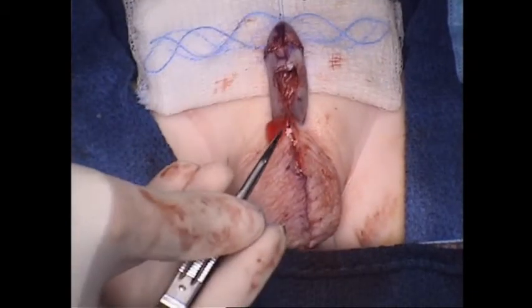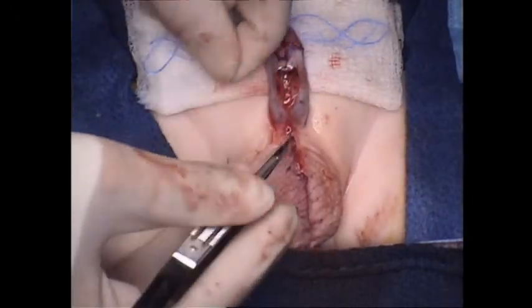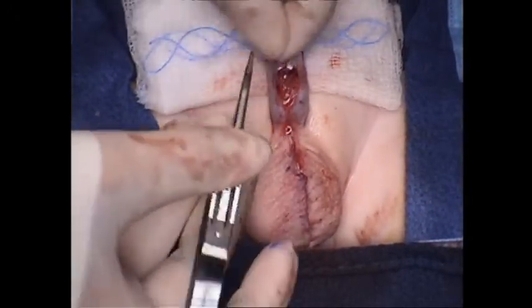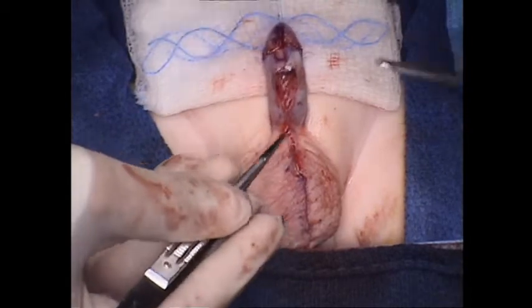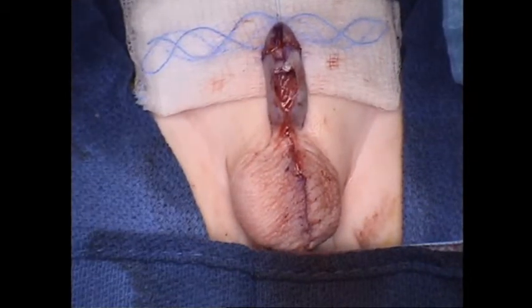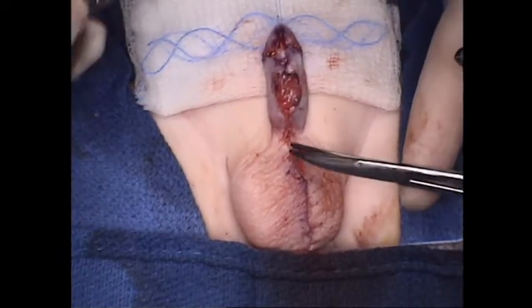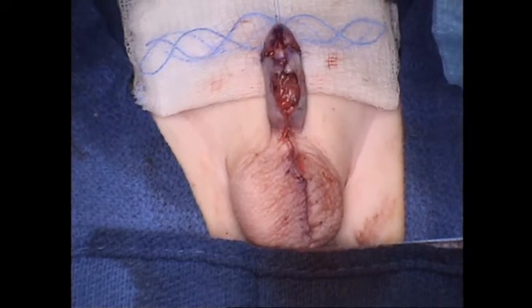I'll take a 9-0. When you have a little bit of PDS right here that is sticking out, it's easy to close with an epithelial suture over it. We'll use a little 9-0 Vicryl so that if a suture tract is left, it's so difficult to see with the naked eye that it's not a functional problem.